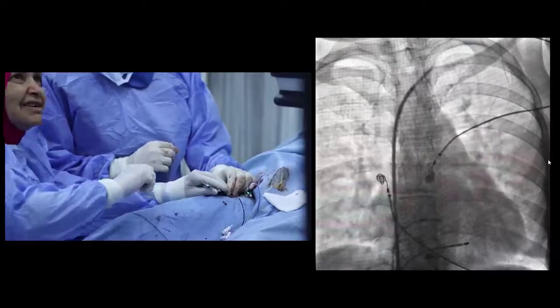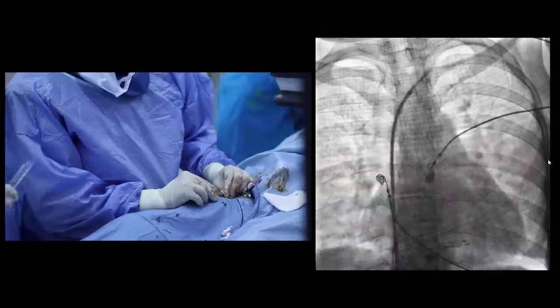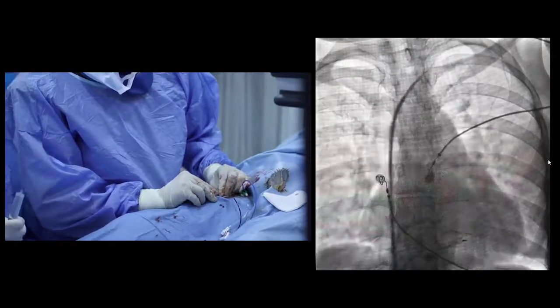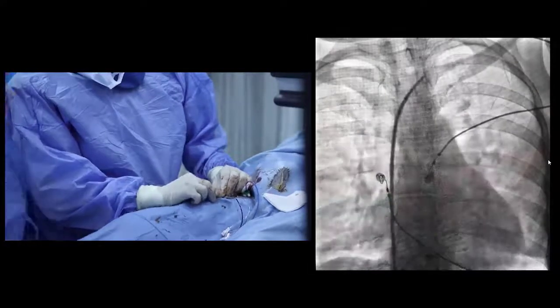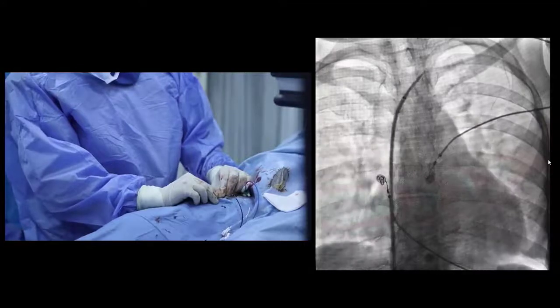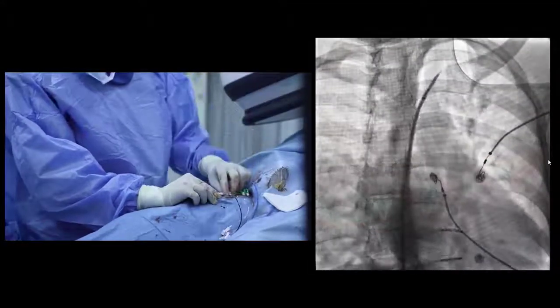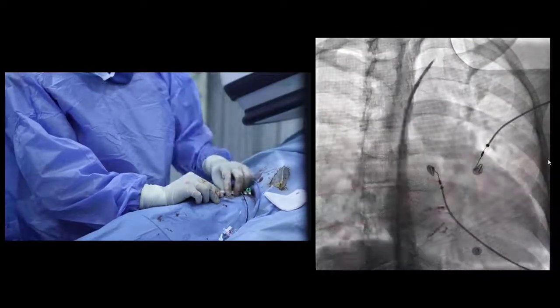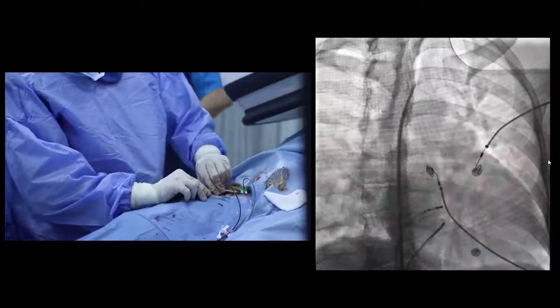The needle and the long sheath are directed clockwise at 5 o'clock. Then we withdraw both. We can see now the needle at the tip of the dilator of the long sheath. We are now trying, in the RAO view, to withdraw the pull at 5 o'clock tilt of the sheath.